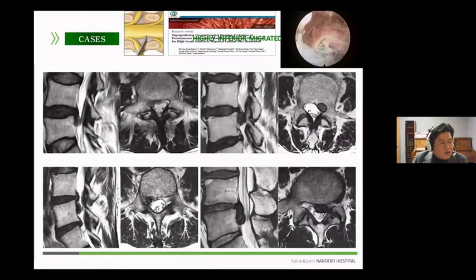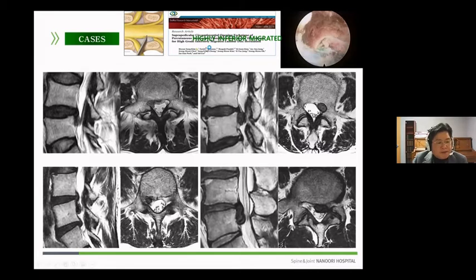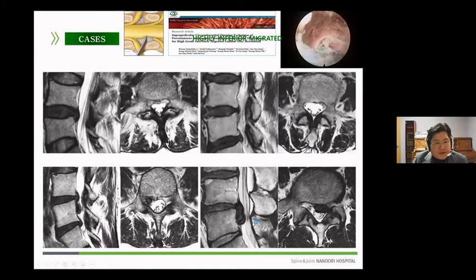In open surgery as well as in transforaminal endoscopic spine surgery, highly inferior migrated discs have always been a challenging problem. However, the advancement of surgical technology, such as the suprapedicular circumferential opening technique and development of instruments, has made it possible to sufficiently solve these problems, as you can see here.